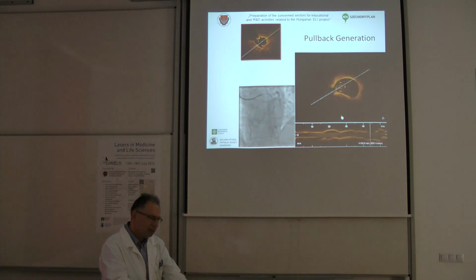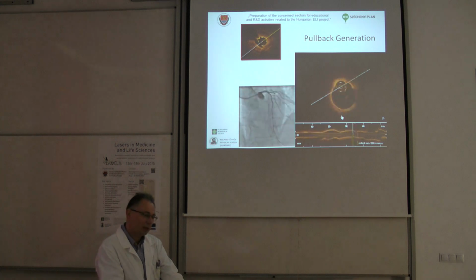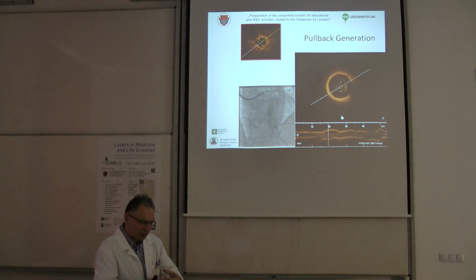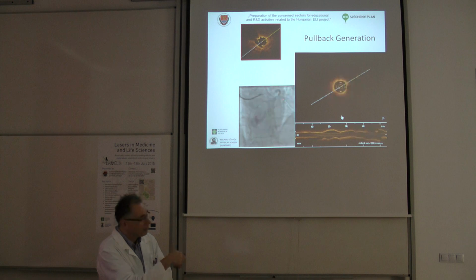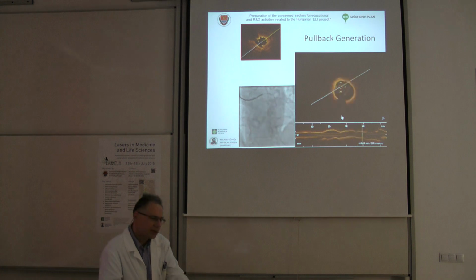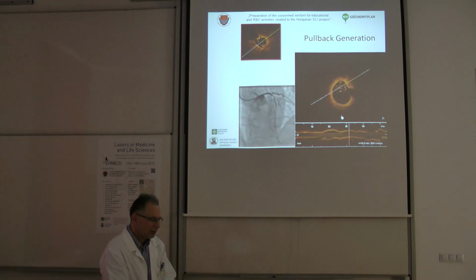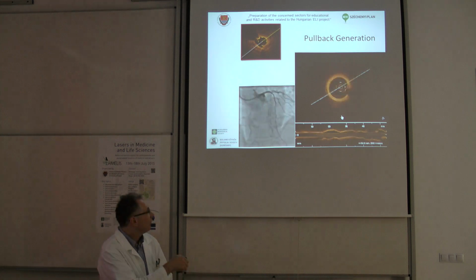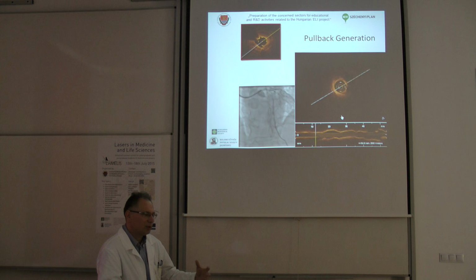And this is really, you can feel it, I can show it in the lab, you can feel it in your hand that this is a jet. Maybe also the rapid blood pressure elevation in this territory can be dangerous when we inject with such a high flow. So this is also a major improvement if you can solve this problem of blood which prevents the image generation inside the blood vessel.